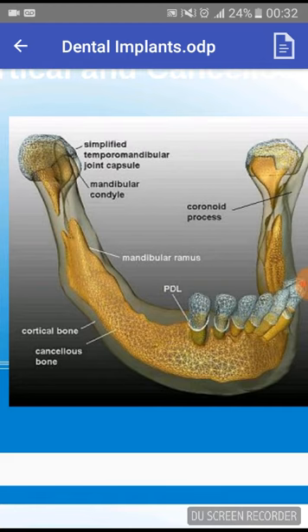Okay. So as I mentioned before, implants can be classified as endosteal, subperiosteal, transosteal, as well as epithelial. So the endosteal is when you place the implant in the alveolar bone or basal bone, and it's placed through one cortical plate.